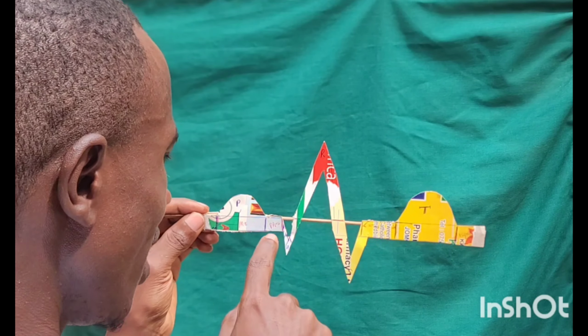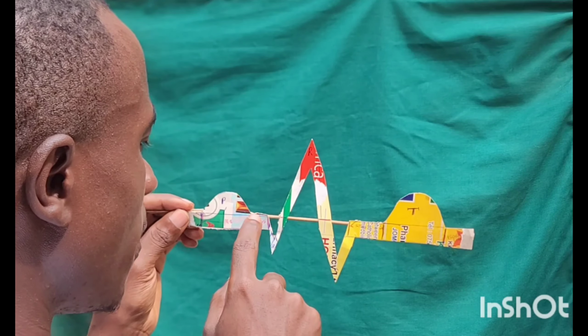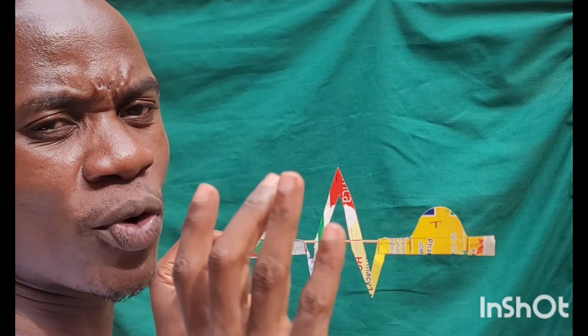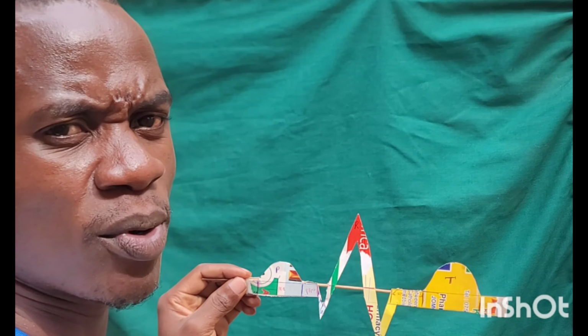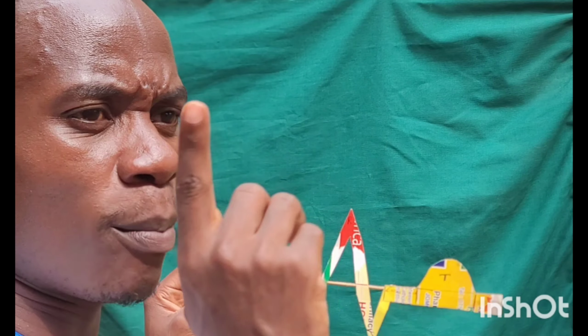Okay. Then when you come over here, we have this segment which we call the PR segment. Super, very important. And this PR segment is going to be an isoelectric line. Now, when you see an isoelectric line, it means that the ECG pointer is now on the neutral position. It's not going to be deflecting to any side. It's going to be on the neutral position.